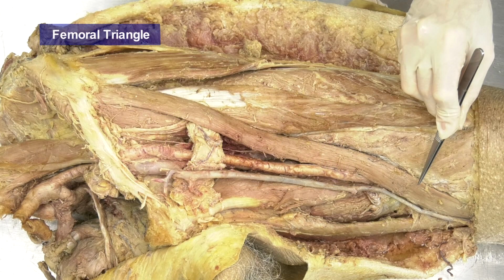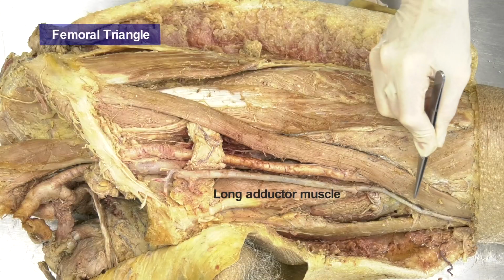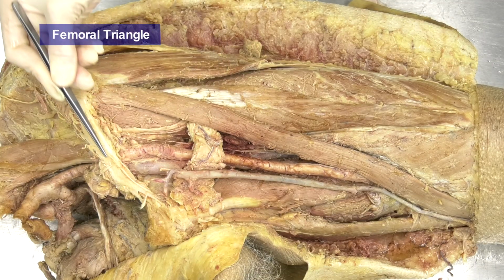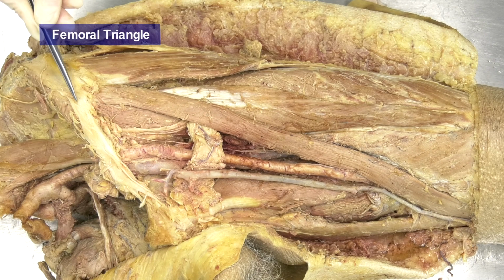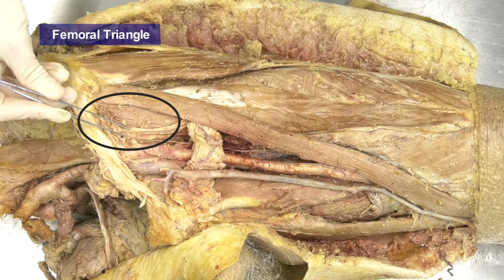The assessment of the inguinofemoral lymph nodes is based on the examination of an area called the femoral triangle. The region is defined by the long adductor muscle medially, sartorius muscle laterally, and the inguinal ligament cranially. The lateral space below the ligament is formed by the musculus lacuna with iliopsoas muscle and femoral nerve passing through it.